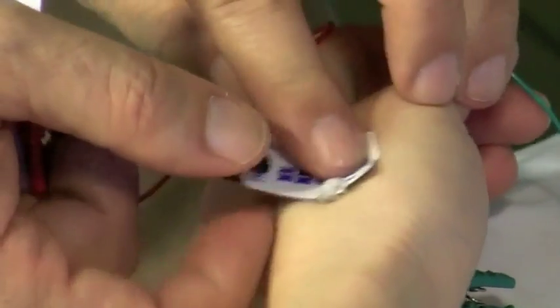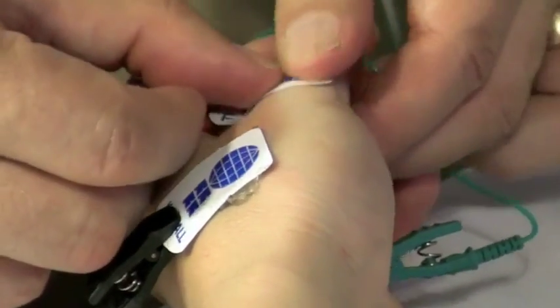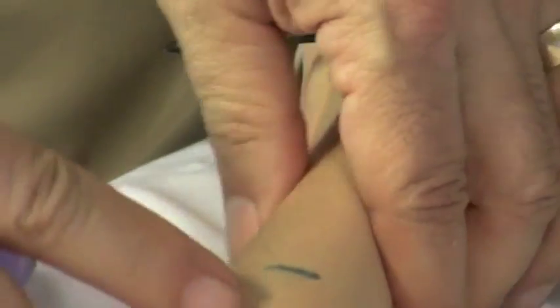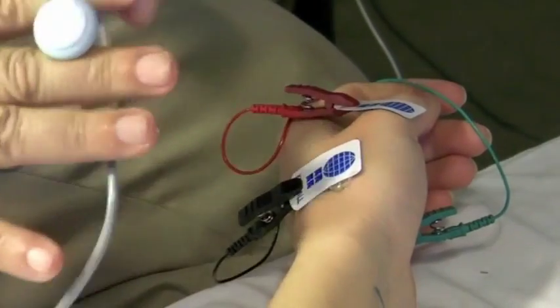And remember, the sensory for the radial was here, so I'm going to put the active electrode here, the black. I'm going to put the reference over the thumb here. Okay, and I'm going to stimulate right where I marked it for the radial nerve. And I stimulate it like so.